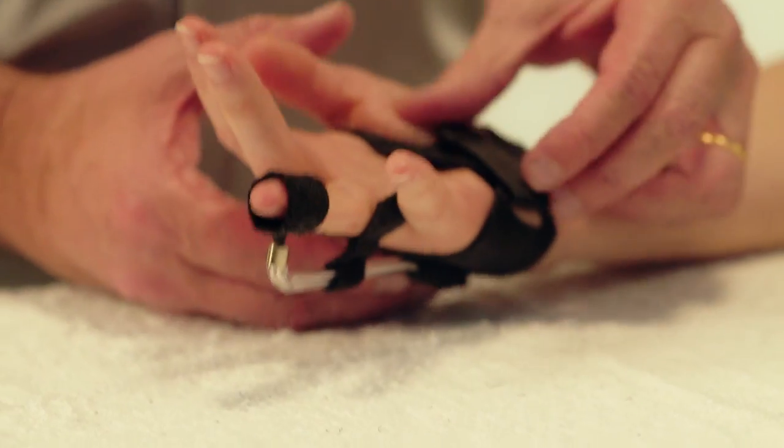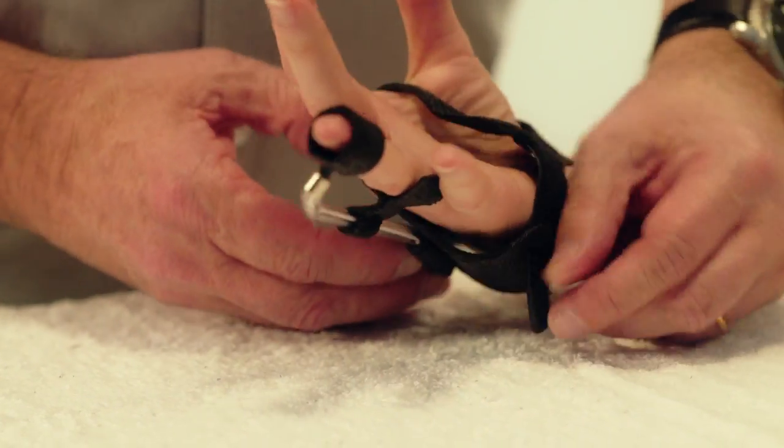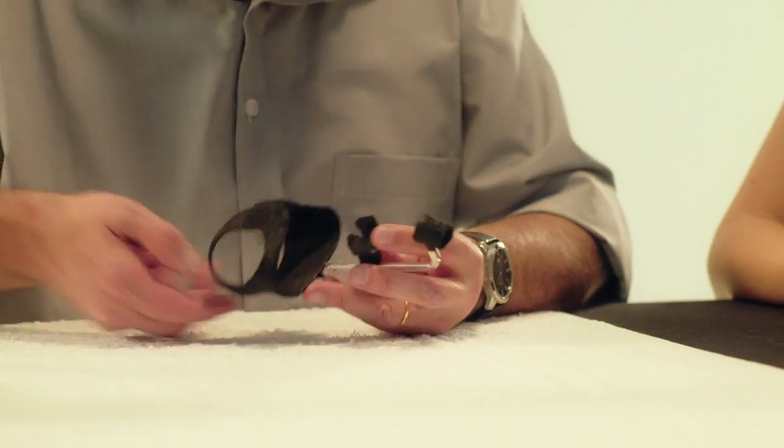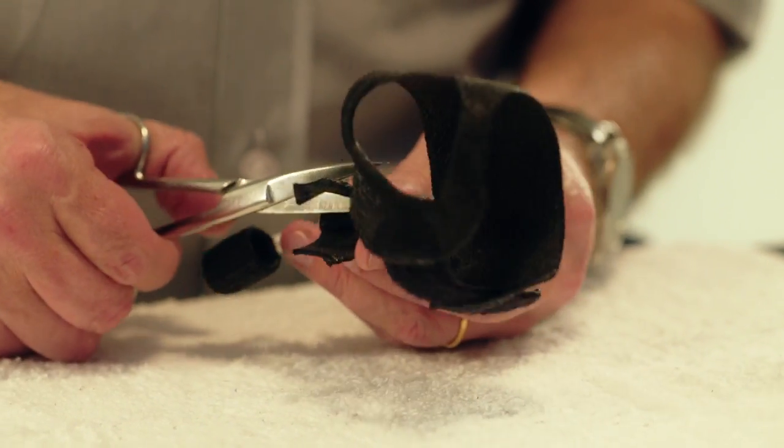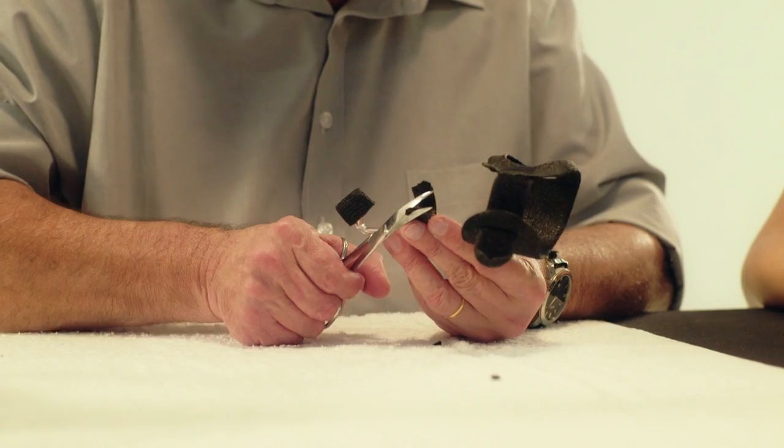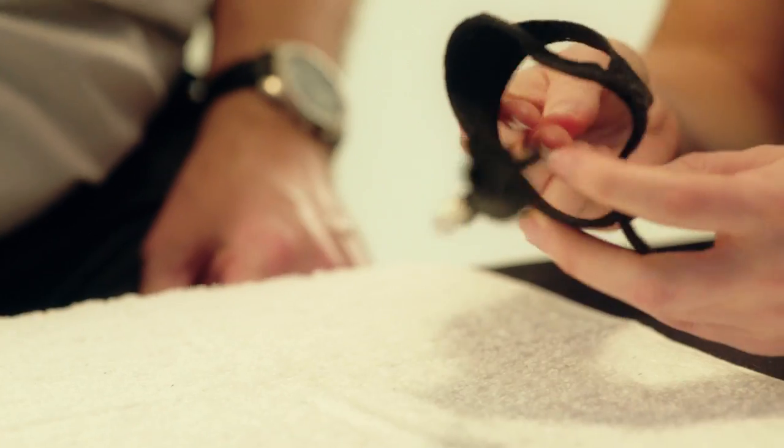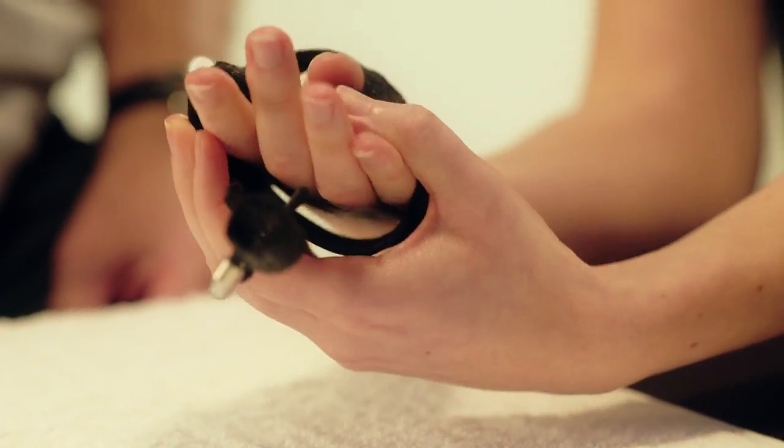Take the orthosis off. Round the edges on both sides of the MCP stop. The orthosis can then be tried on again.